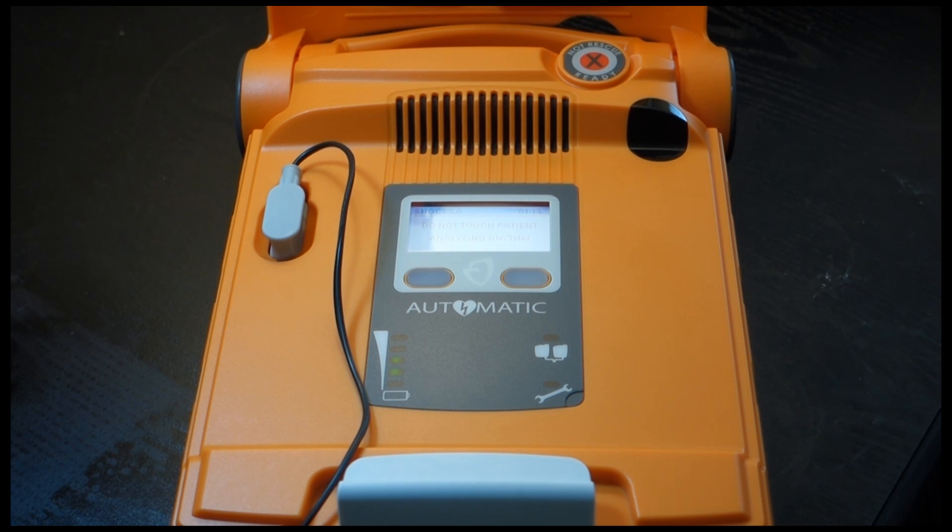Do not touch the patient. Analyzing heart rhythm — please wait. Shock advised. Do not touch the patient. Shock will be delivered in 3, 2, 1. Shock delivered.